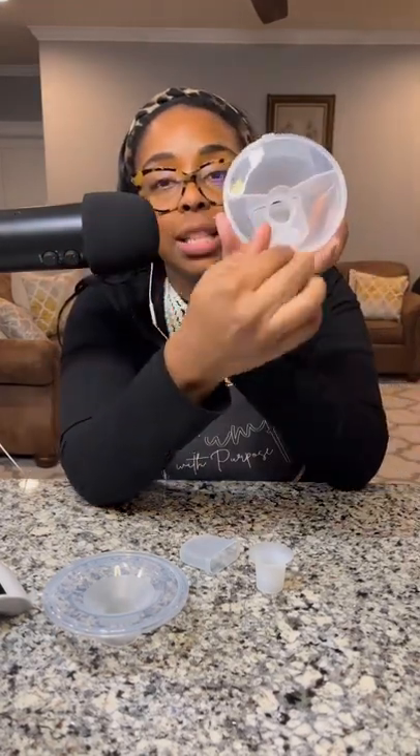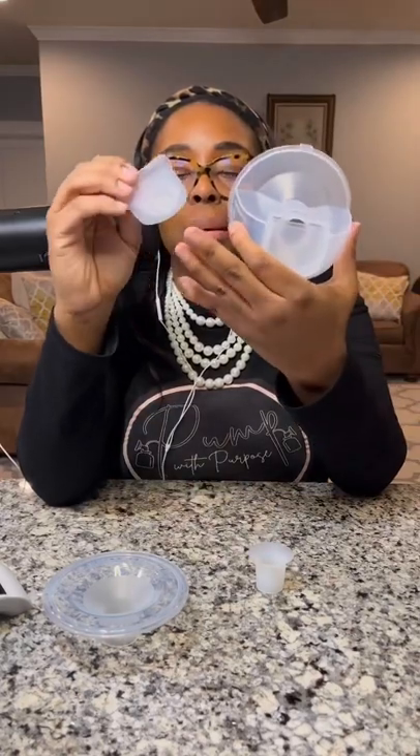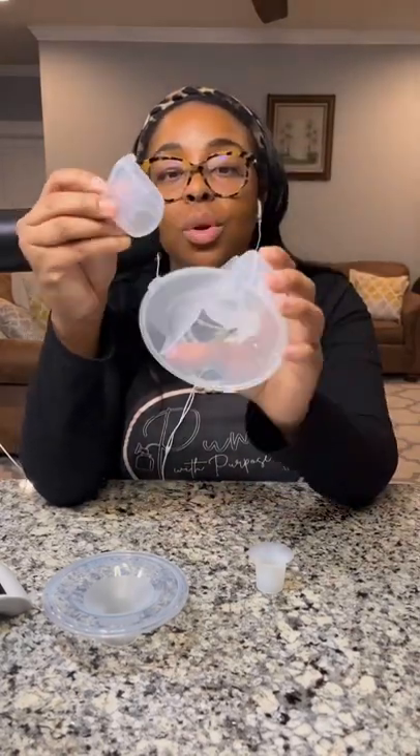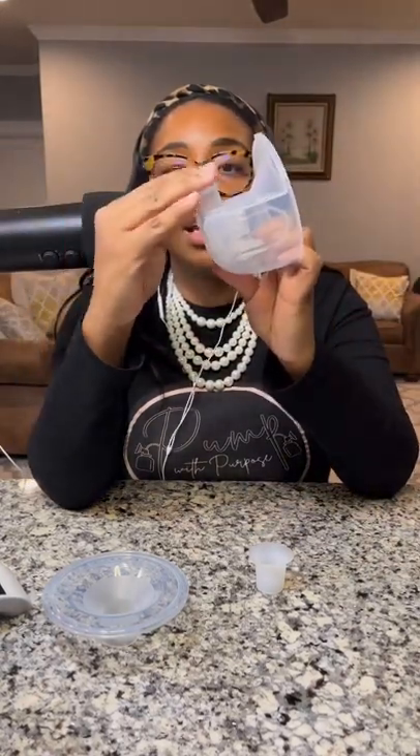So this is the duck bill — it goes on just like this. Keep in mind that some wearable pumps have the duck bill going up and down, but this one sticks out as well. Then the backflow protector has a ridge here and a ridge here — you want it facing the inside. You put it on, pop it down, and it is good to go.